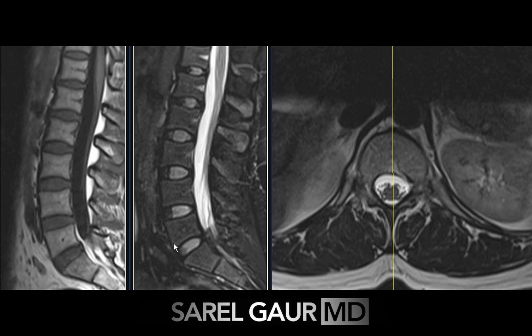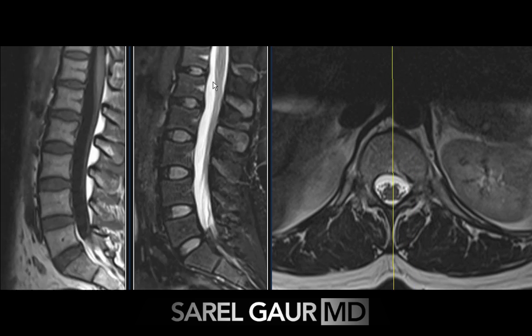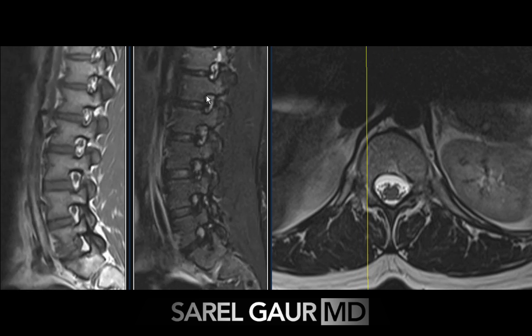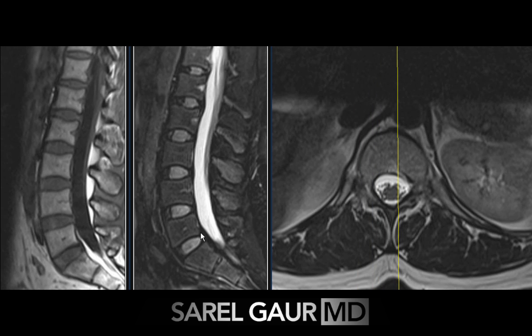I then start looking at each vertebral body for any height loss, looking at the relationship between the vertebral body and the intervertebral disc — looking for any loss of height or compression. I then use the STIR imaging, looking for any high signal in the vertebral body or the ligaments that surround it, looking for any evidence of acute injury.